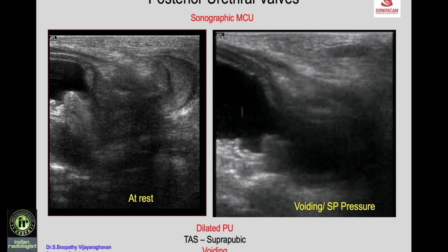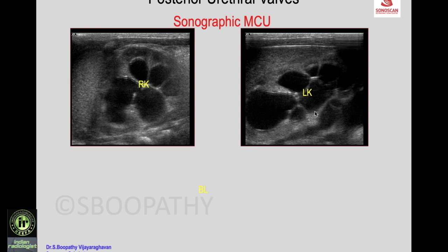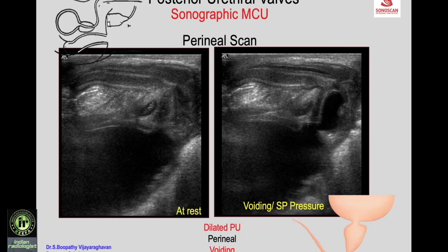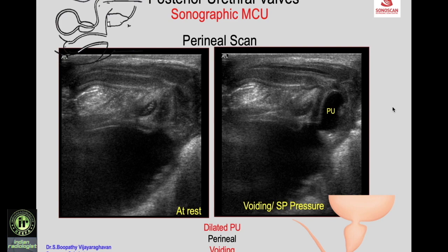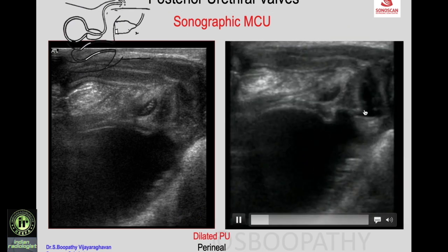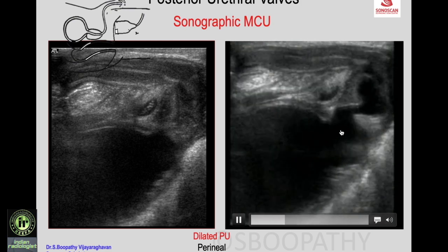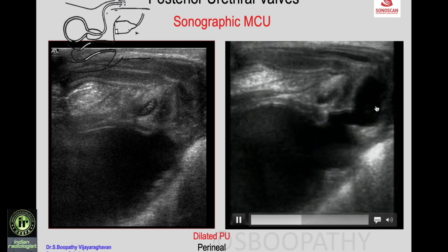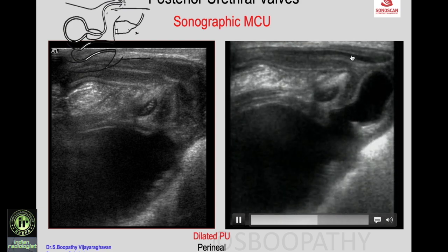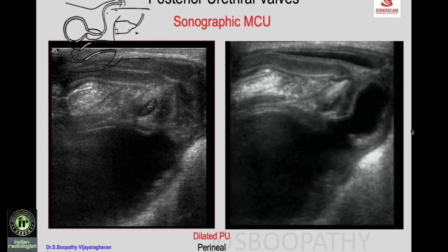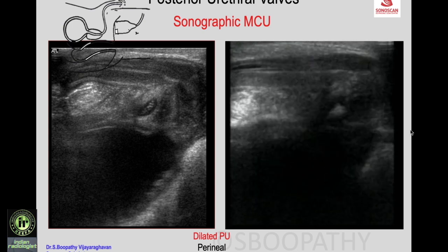Another patient with bilateral hydroureteronephrosis shows a thick-walled bladder. Perineal scan at rest shows no posterior urethral dilatation, but with suprapubic pressure or voiding, there is huge dilatation of the posterior urethra and a narrow anterior urethra, confirming posterior urethral valves. Video confirms: at rest no dilatation; with voiding, the thick-walled bladder and dilated posterior urethra with narrow anterior urethra are seen — the sonographic micturating cystourethrogram.